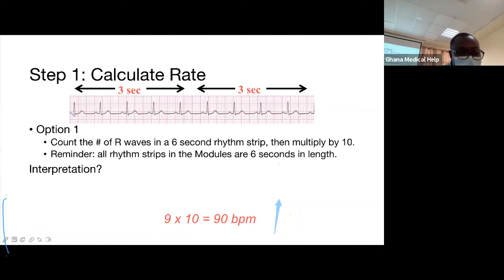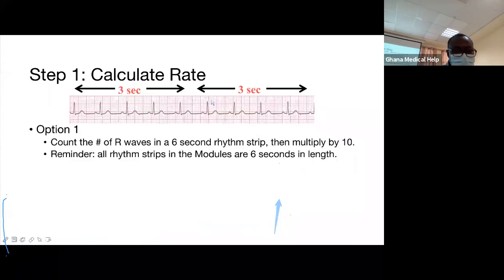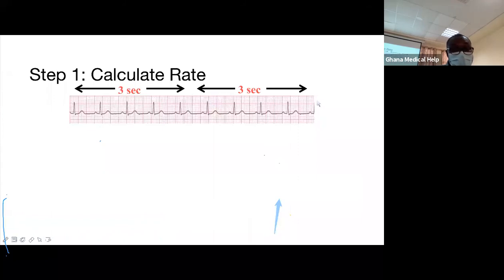So if we multiply 0.04 by 30 boxes, up to 30.